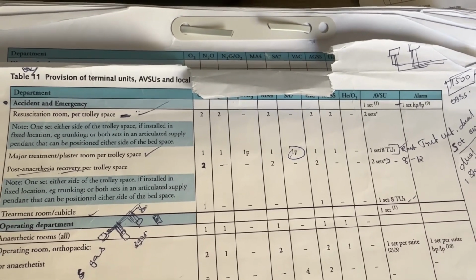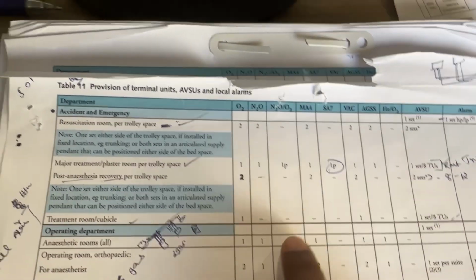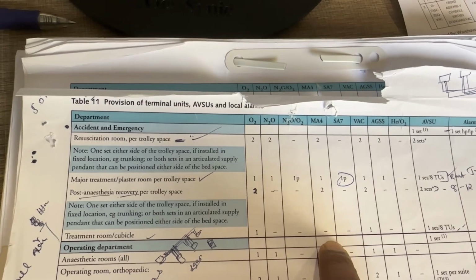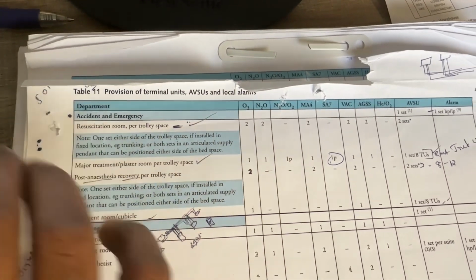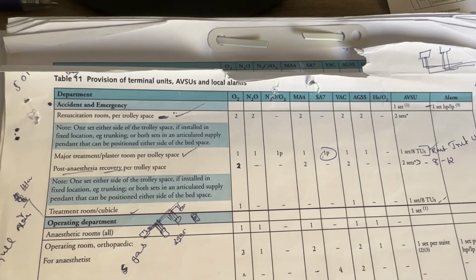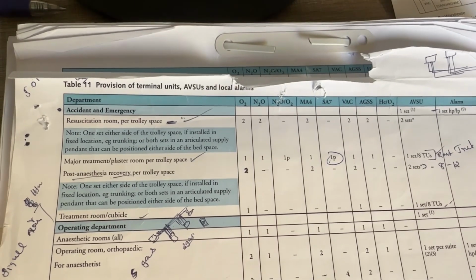As per HTM only oxygen and vacuum are required. But in most cases for the treatment room we give medical air also, as per project requirement. For triage or vital and exam observation we give only oxygen and vacuum, but for the treatment room we give three gases: oxygen, medical air and vacuum.